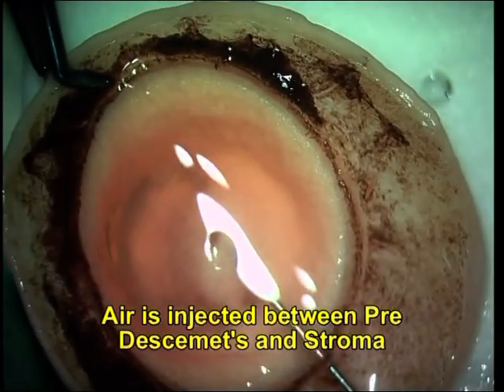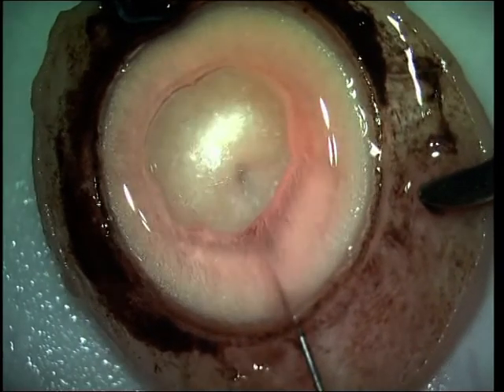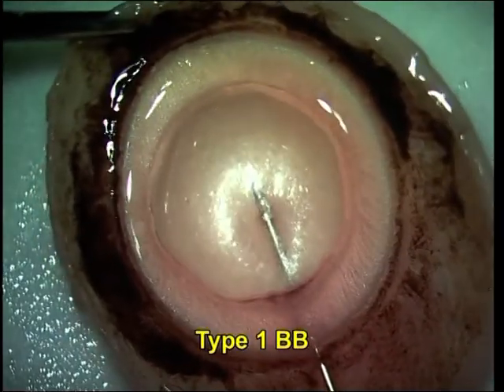Air is slowly injected until a Type 1 big bubble is formed, and injection continues until the desired size of the big bubble is achieved without allowing it to break.